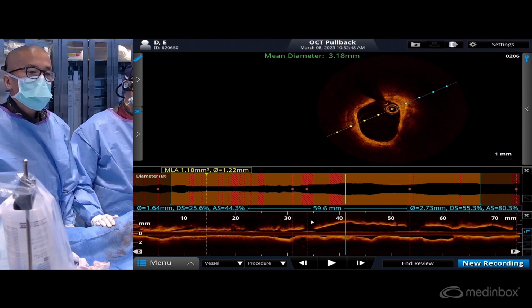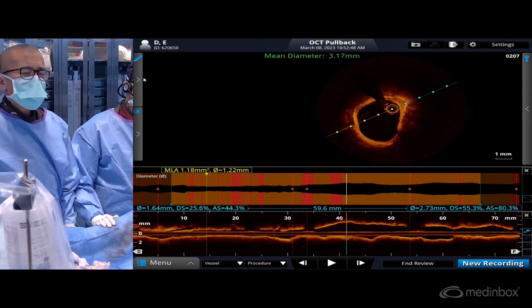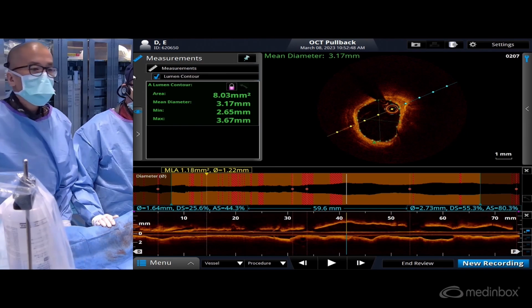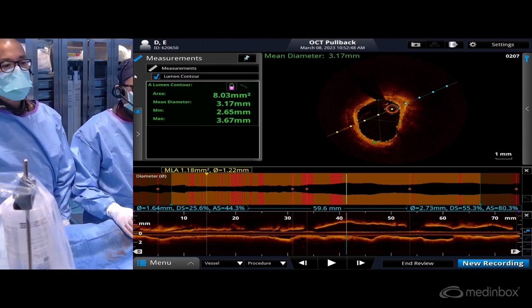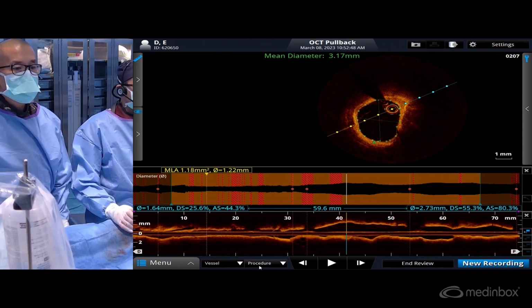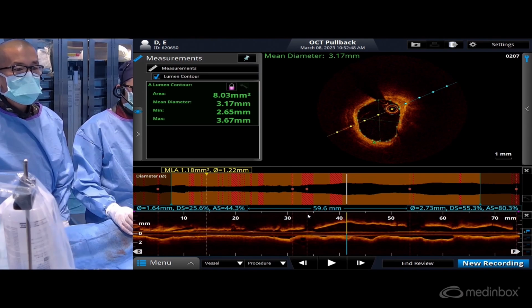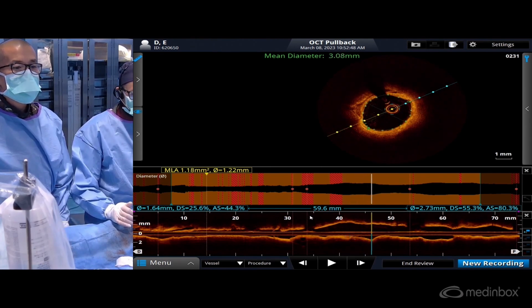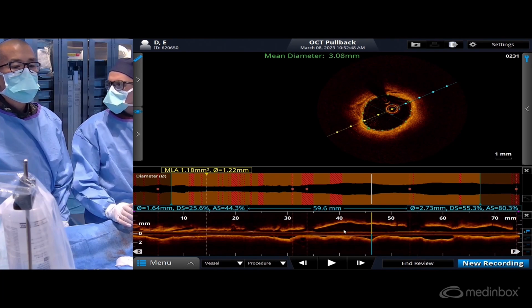So you see the burden of calcium says that it might require... Stop là, fais un contour. We're just going to measure. So we're at 3.65. So getting a 3.5 shock wave might be a good assessment. Recule. Va dans les 50. Encore. Stop là.